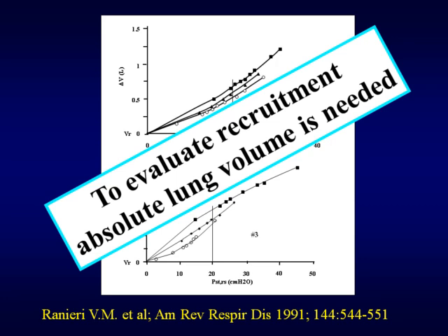Second, if I measure actual lung volume, I can get a pretty good idea of how much lung I am recruiting. And this without doing a CT scan, because doing a CT scan is very precise, but it's not very simple to do at the bedside.